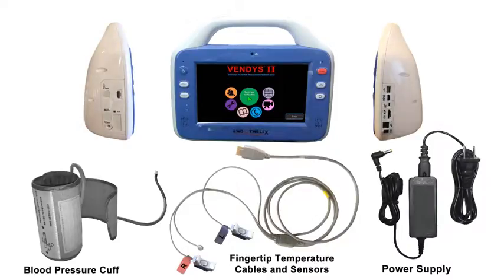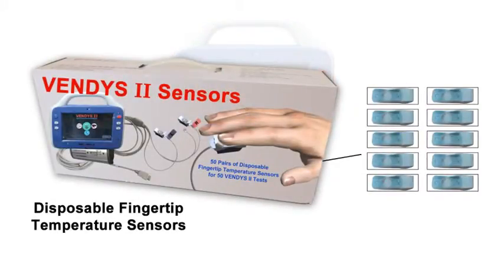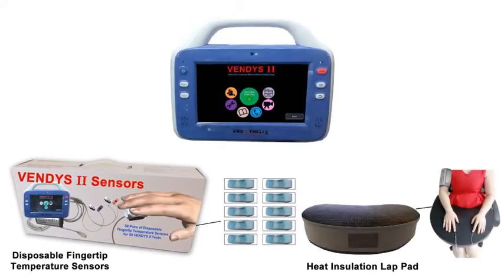Now you're ready to start a Vendis test. Before starting the test, make sure that you have unused disposable adhesive clips for the fingertip temperature sensors. The clips are found in the box labelled Vendis 2 sensors, as seen here. The heat insulation pad, shown here, also comes with Vendis 2. It is used to isolate the hands from heat emitting from other body parts.